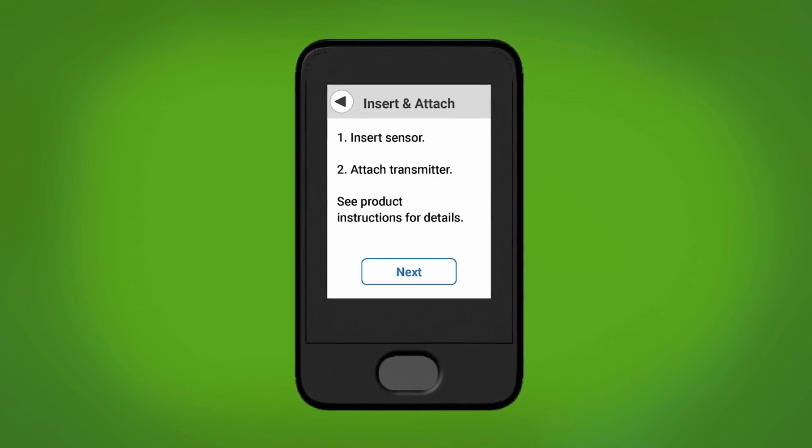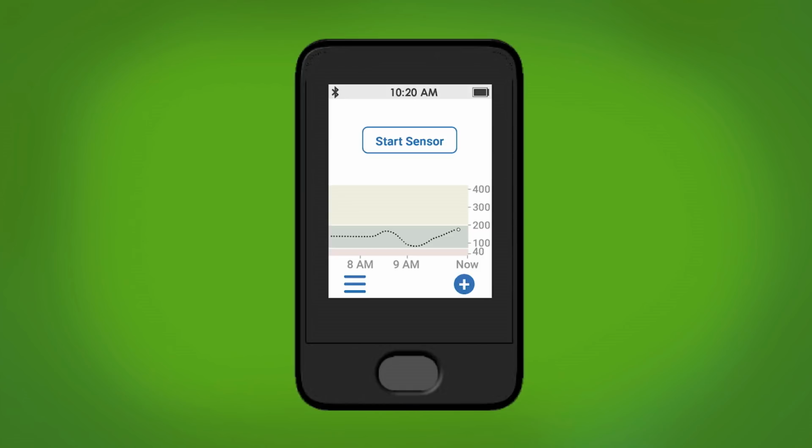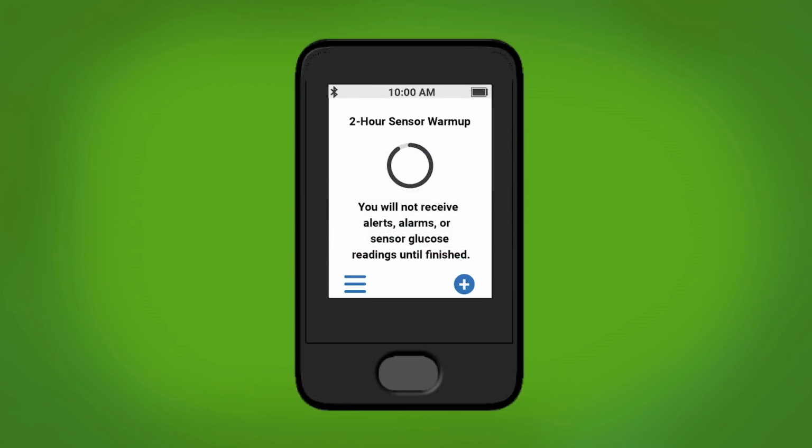Now back on your receiver, tap Next and then tap Start Sensor. Now your sensor warm-up has begun. The warm-up will take 2 hours to complete. You will not receive alerts or readings during this 2-hour sensor warm-up.